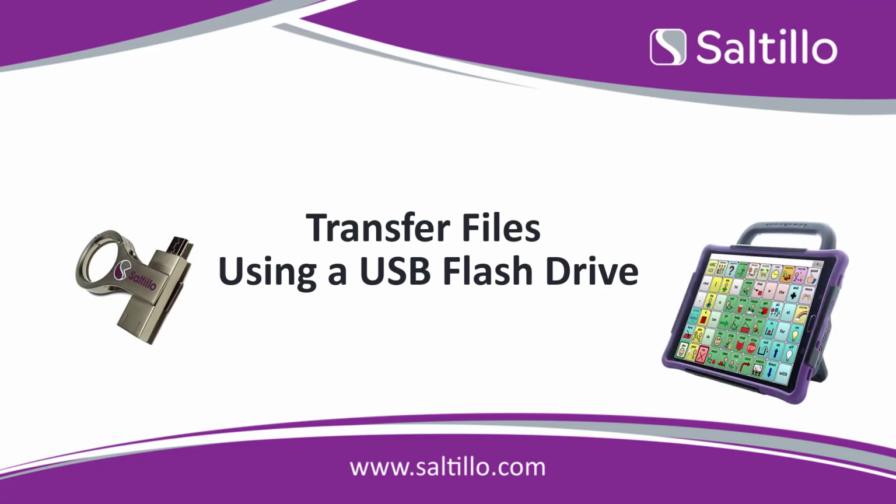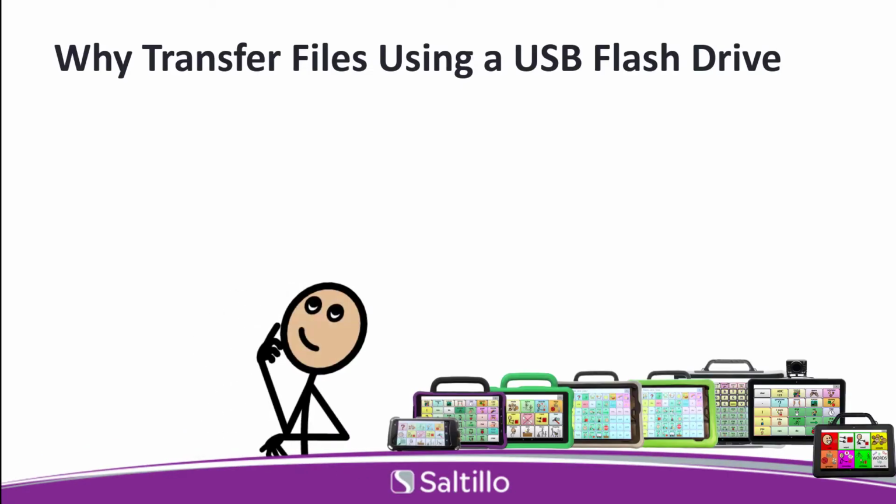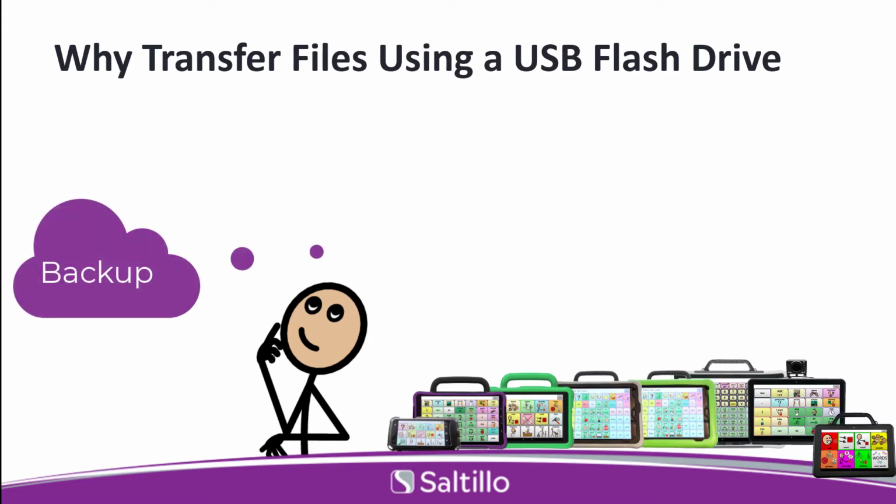This video will demonstrate how to use a USB to transfer vocabulary files. There are a number of reasons to use the USB for file transfer. It is always a good idea to have a backup of a customized file. This is simply good practice.